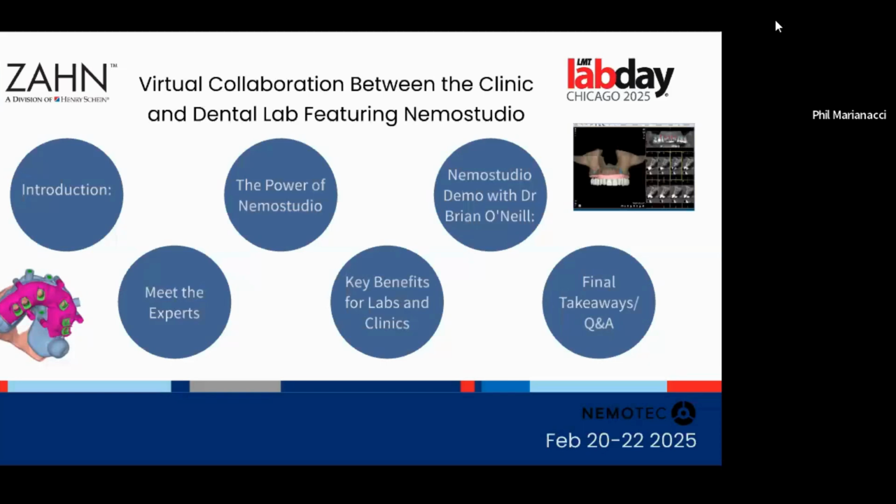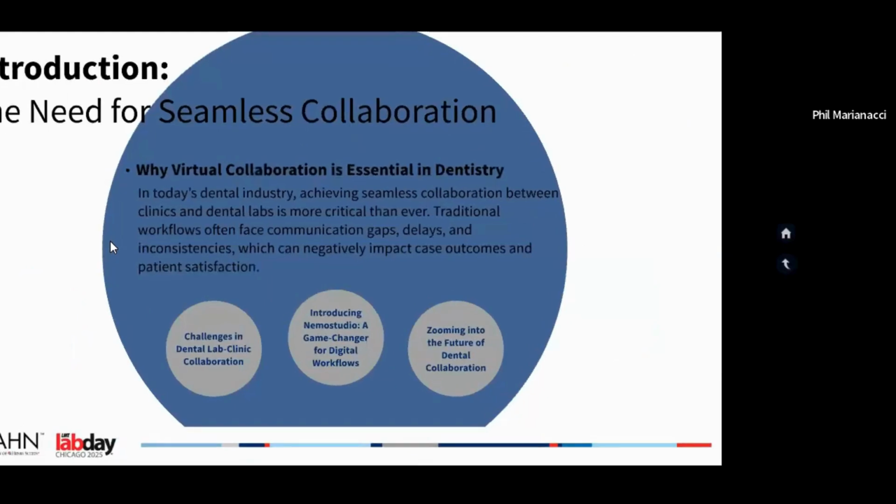All right. Again, thanks for being on here. Before I get into a little bit of background on me, I wanted to talk a little bit more about the introduction of Nemo and why this is. Why the collaboration is essential, and it's really achieving seamless collaboration between the clinics and the dental labs is very crucial. I'd say it has to be. In the coming years, that's what people are going to value.